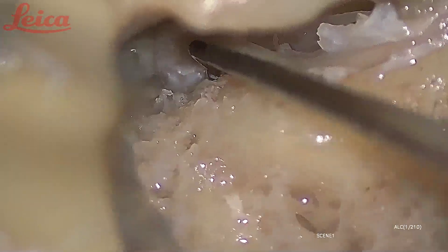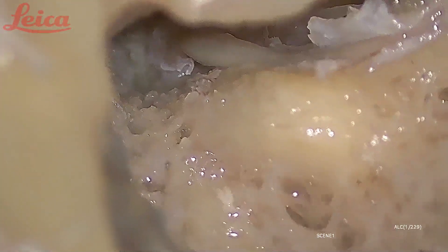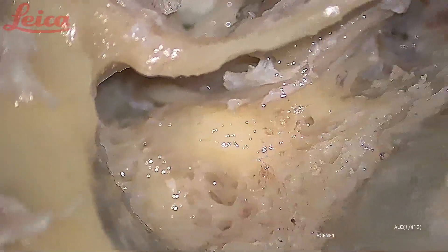This is how you can decompress the complete nerve — from the meatal foramen up to the stylomastoid foramen through the transmastoid approach. This is a very important procedure because everybody is scared about the facial nerve, and unless you do repeated facial decompressions on a cadaveric bone, you will not have the confidence to do this surgery.